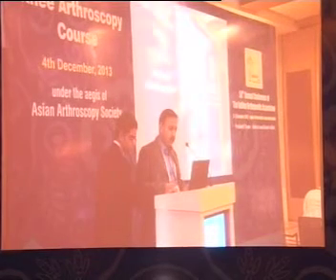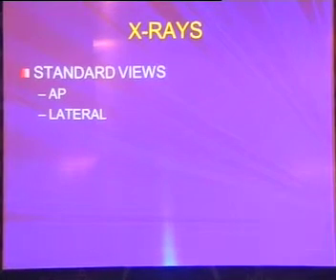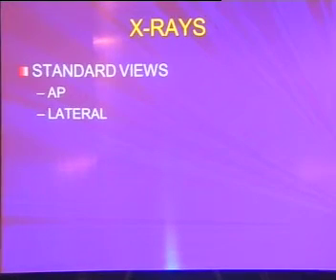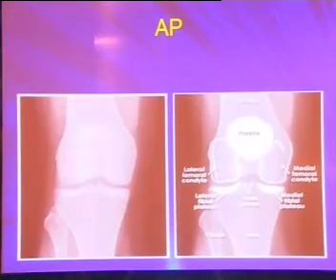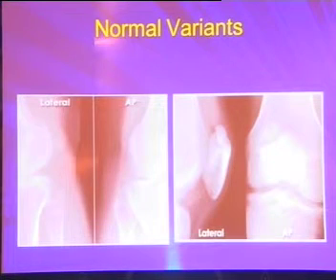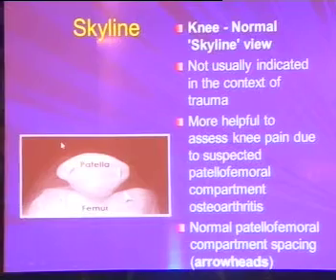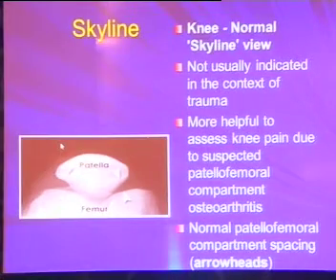Now, imaging of the knee is very essential. We all can read plain X-rays, so we'll just rush through it. These are the AP and lateral X-rays which we usually do, and one can be confused by injuries like this, such as the sesamoid bones which are present on the posterolateral aspect. Many a time we advise a merchant view for patellofemoral problems.